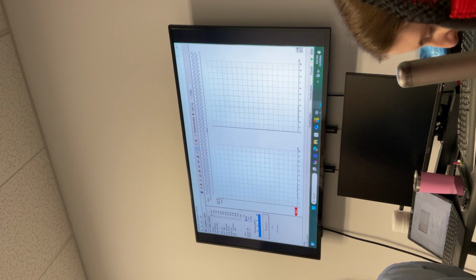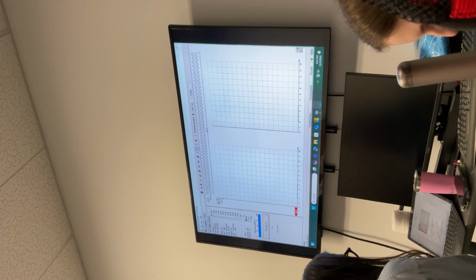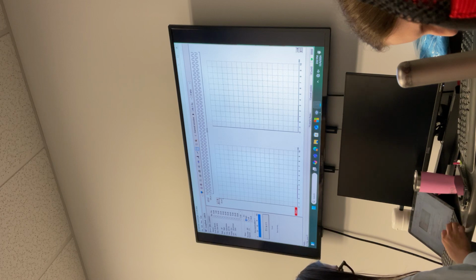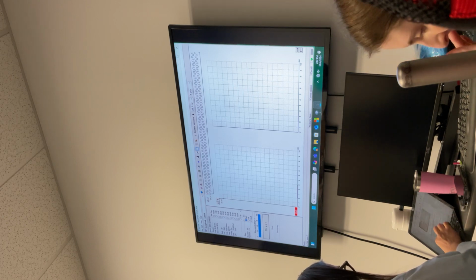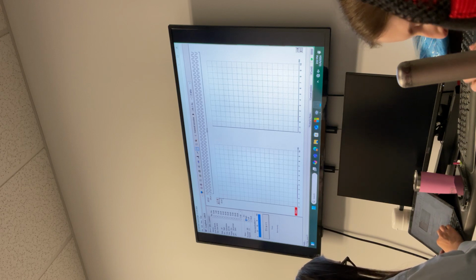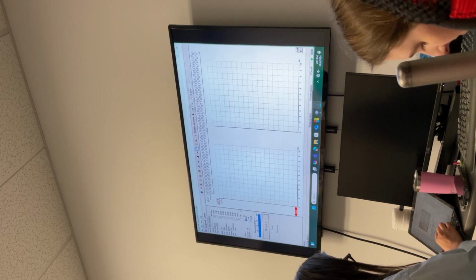You can just use the clean side to take out, this one. And also, you need not even record at 70. You can start directly at 30. It's all normal hearing if you're confident. Initially, on broadband, you start at 70, but on narrowband you just start at 30.